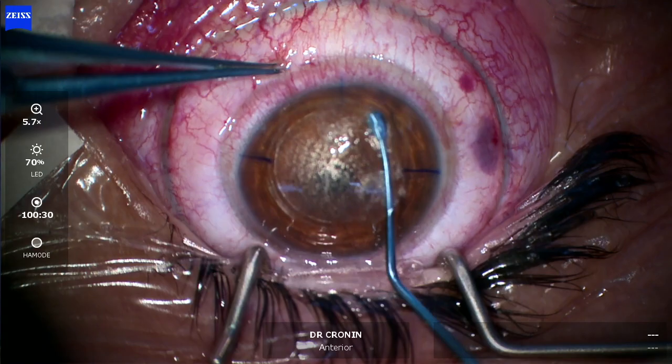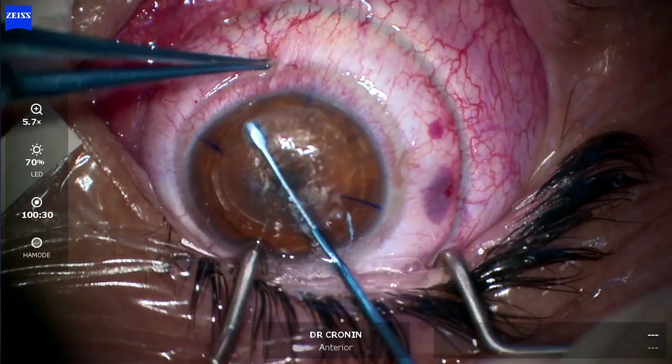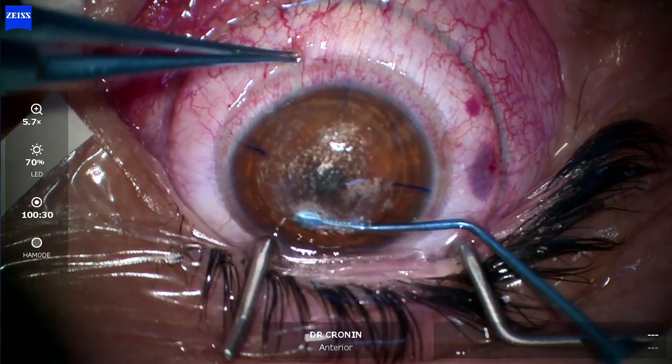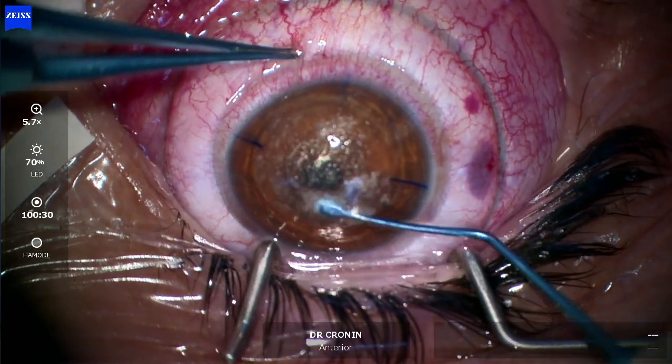In this case, I've used two incisions, which can be done on the Zima Z8 laser — one for the anterior and one for the posterior — but most of the time I just use one incision. In this case, I had difficult access.